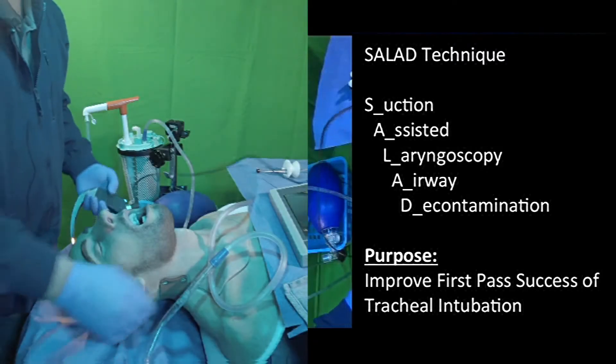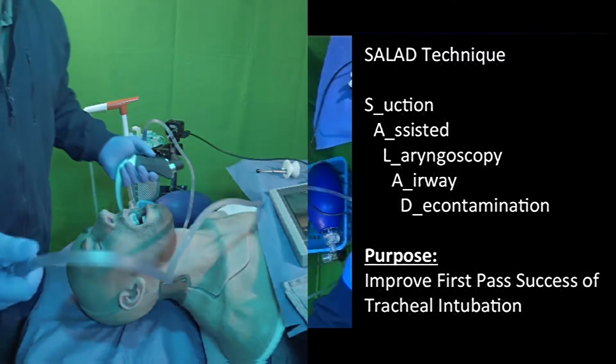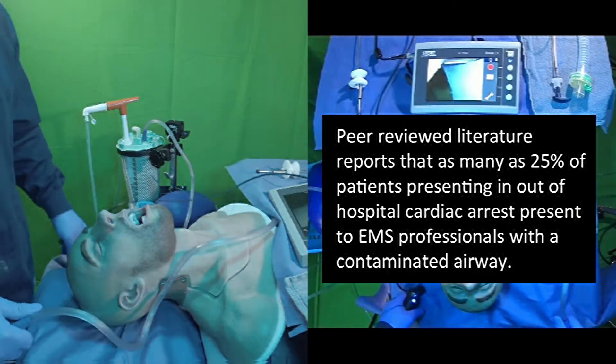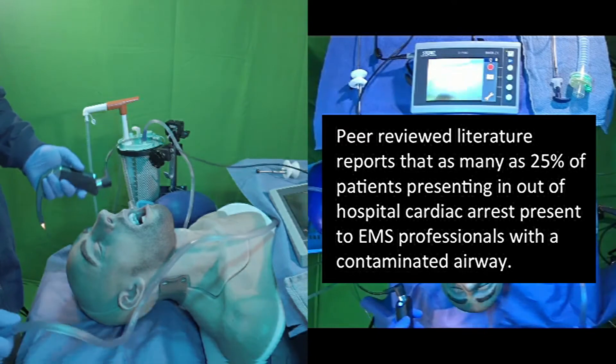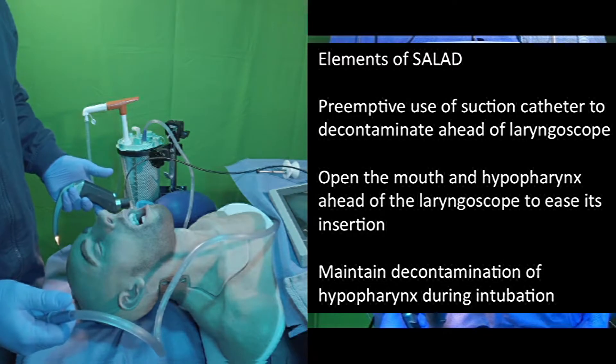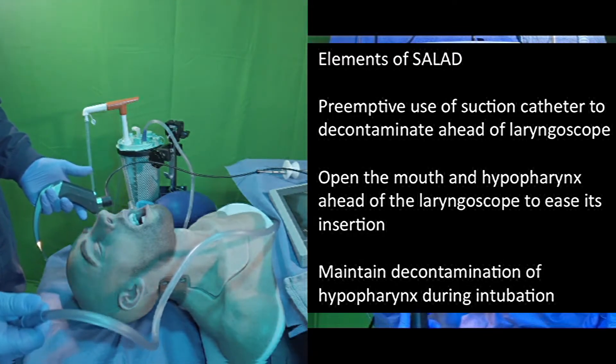The basic SALAD technique. Especially in pre-hospital environments, about 25% of the patients we encounter in cardiac arrest are going to have a soiled airway. So finding a way to effectively manage those airways and get that quick first-pass success on our intubations is even that much more important.